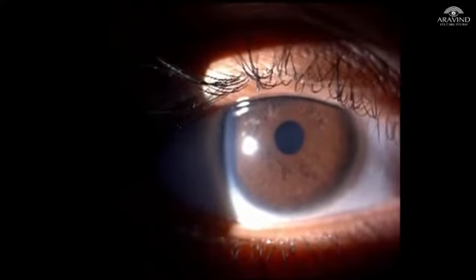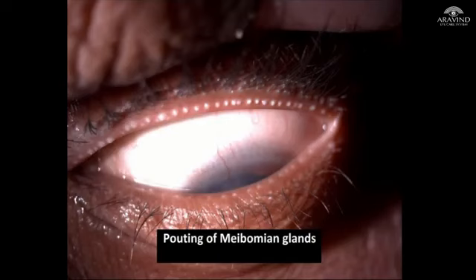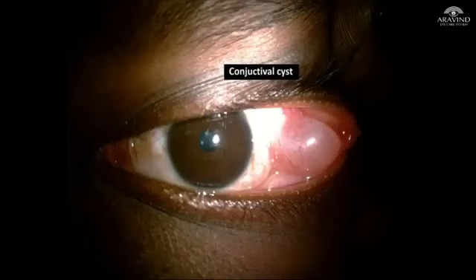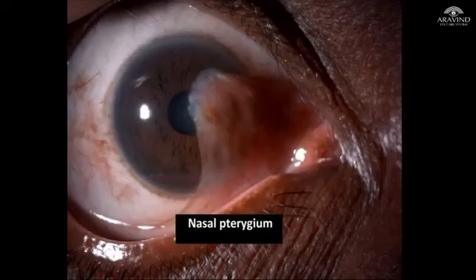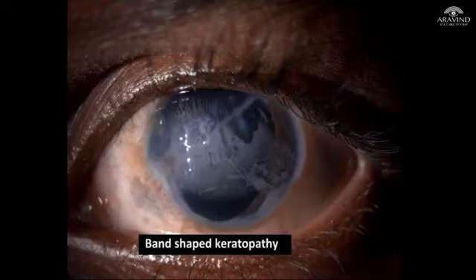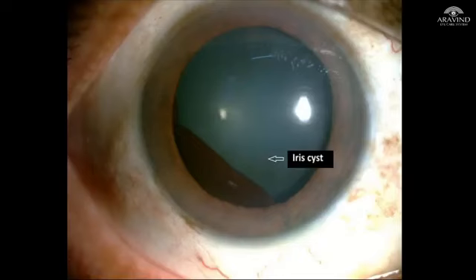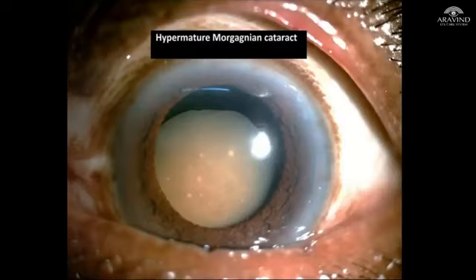Few pathologies that can be seen are lid swelling, pouting of the meibomian gland, conjunctival cyst, nasal pterygium, conjunctival nevus, band-shaped keratopathy, microspherophakia, iris cyst, and hypermature Morgagnian cataract.